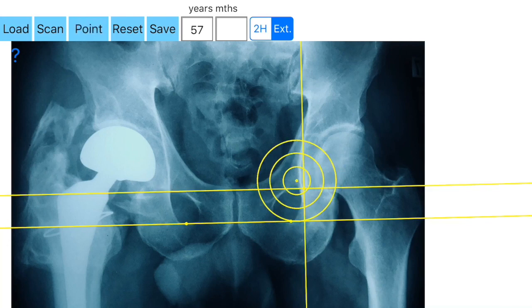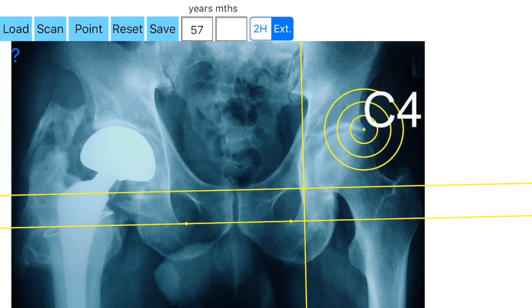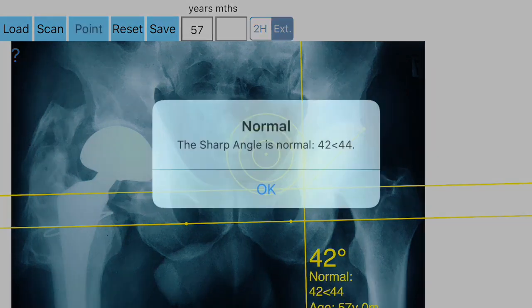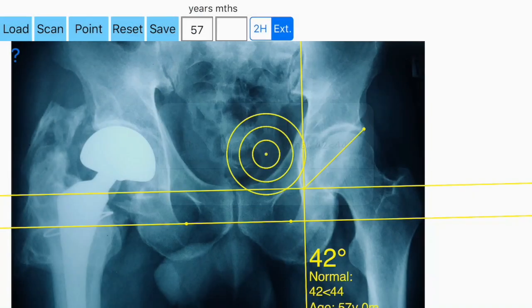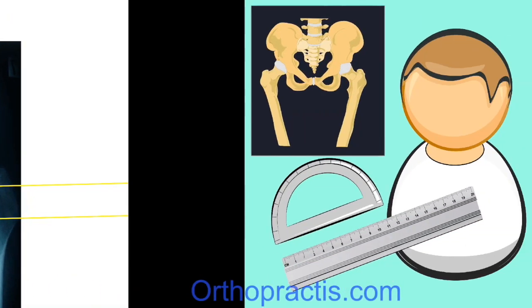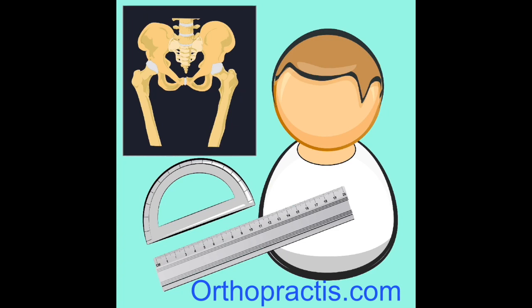Now you are ready to mark, by pressing the point option, the left acetabular border C4 left, by the same technique as described above. Then automatically the left AA angle is measured and the value is printed on the screen after being compared to the reference database based on the age of the patient. The hip is then categorized as normal or borderline dysplastic. Please see more tutorial videos at the developer site.